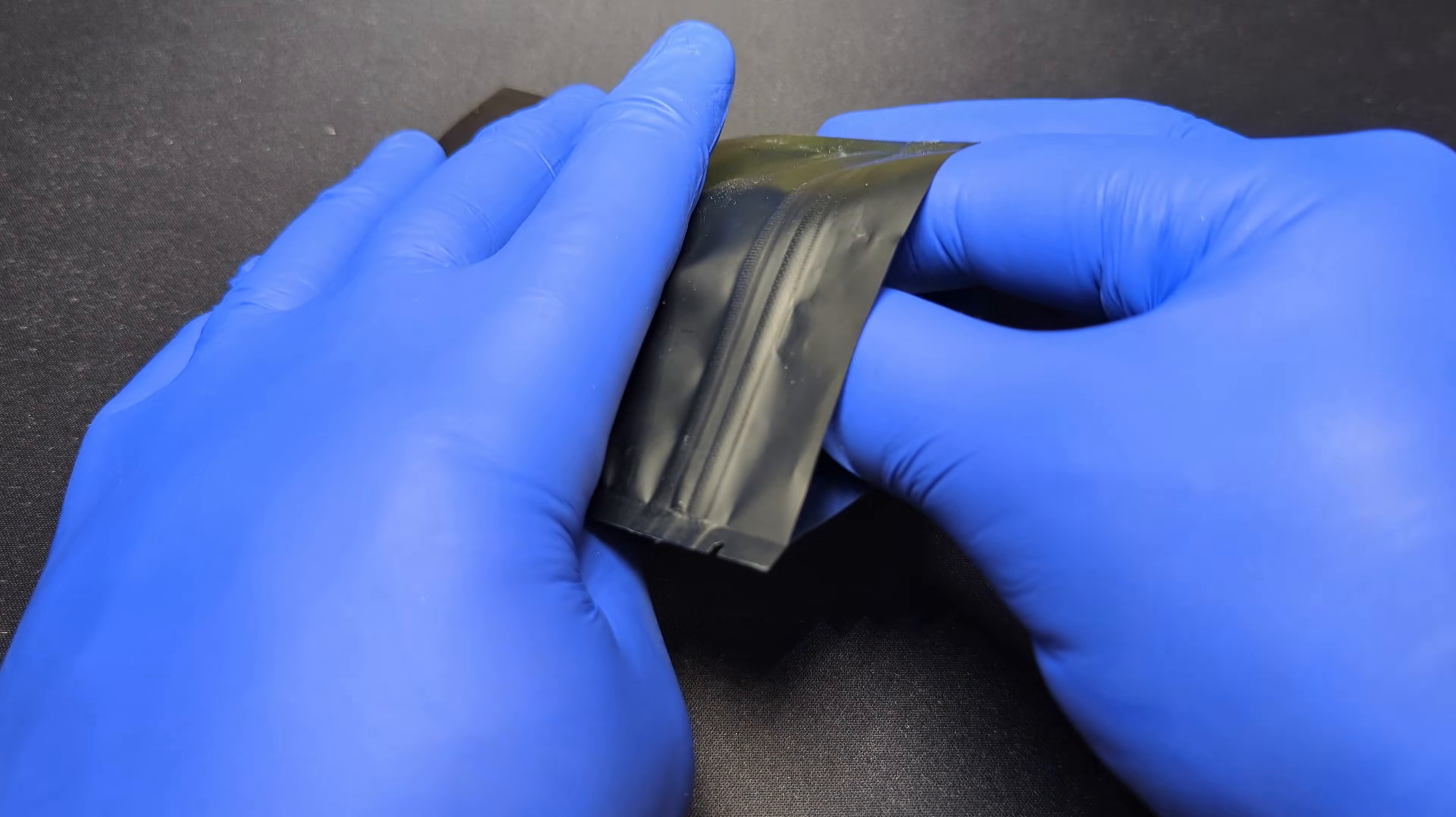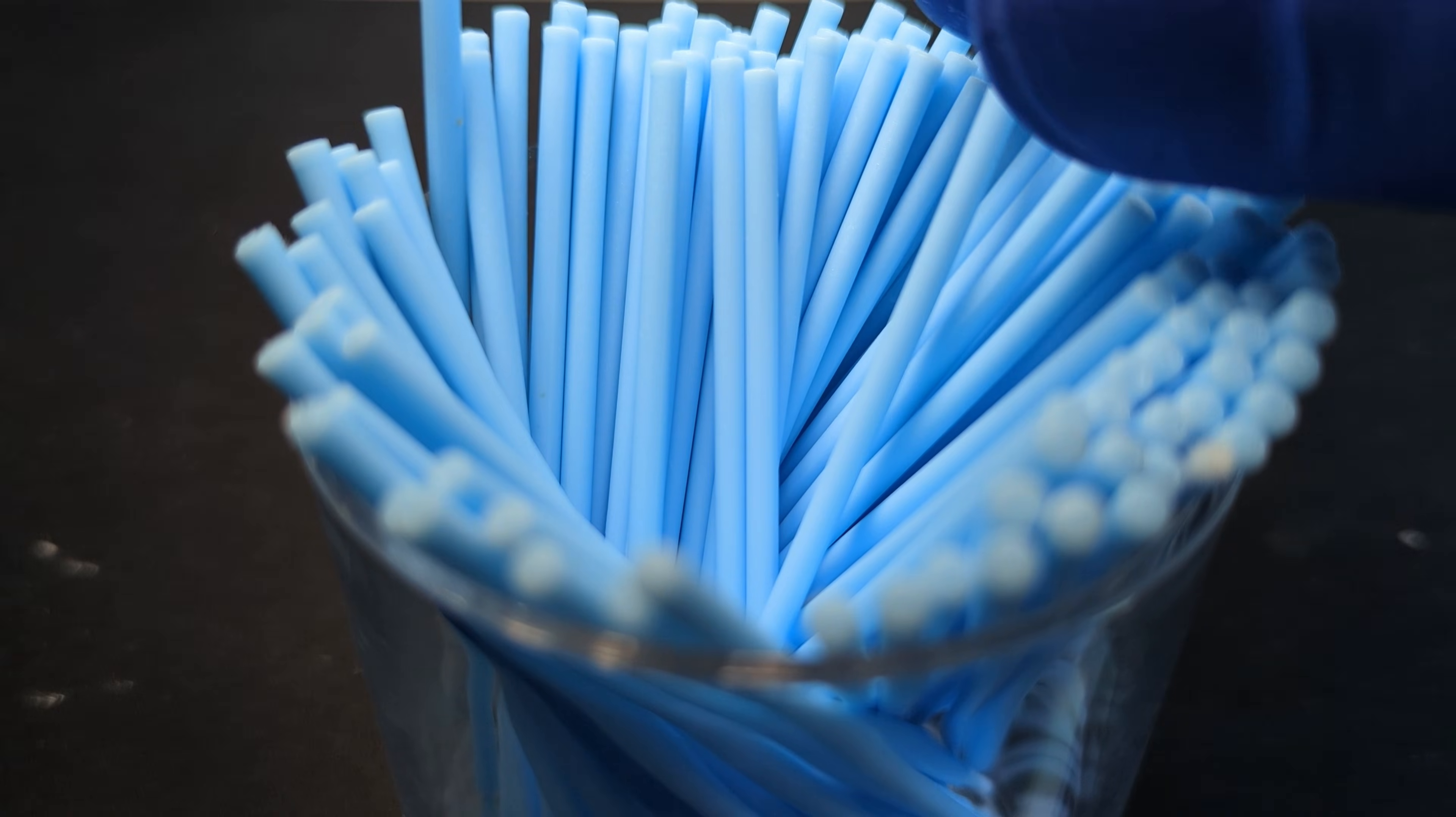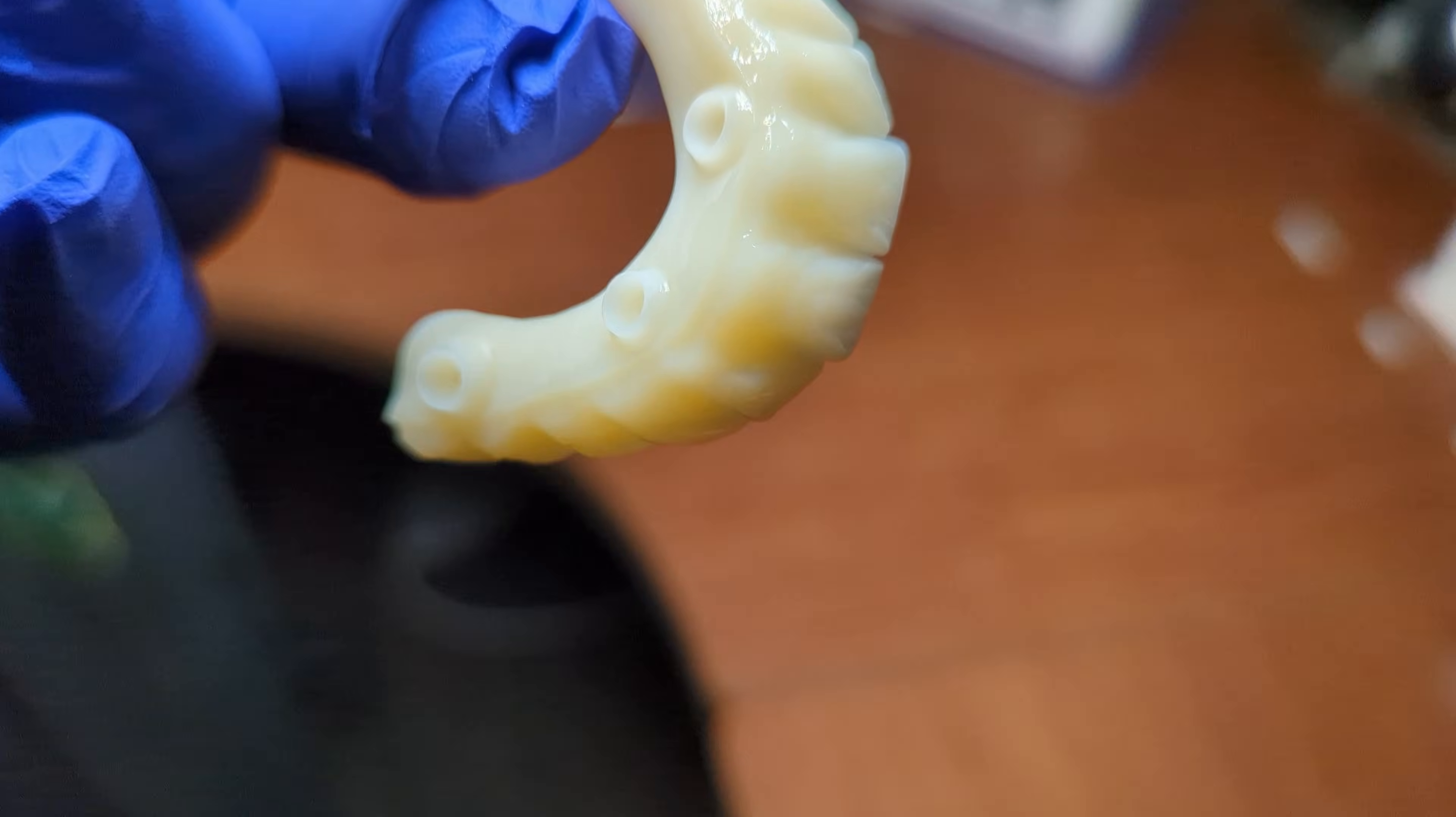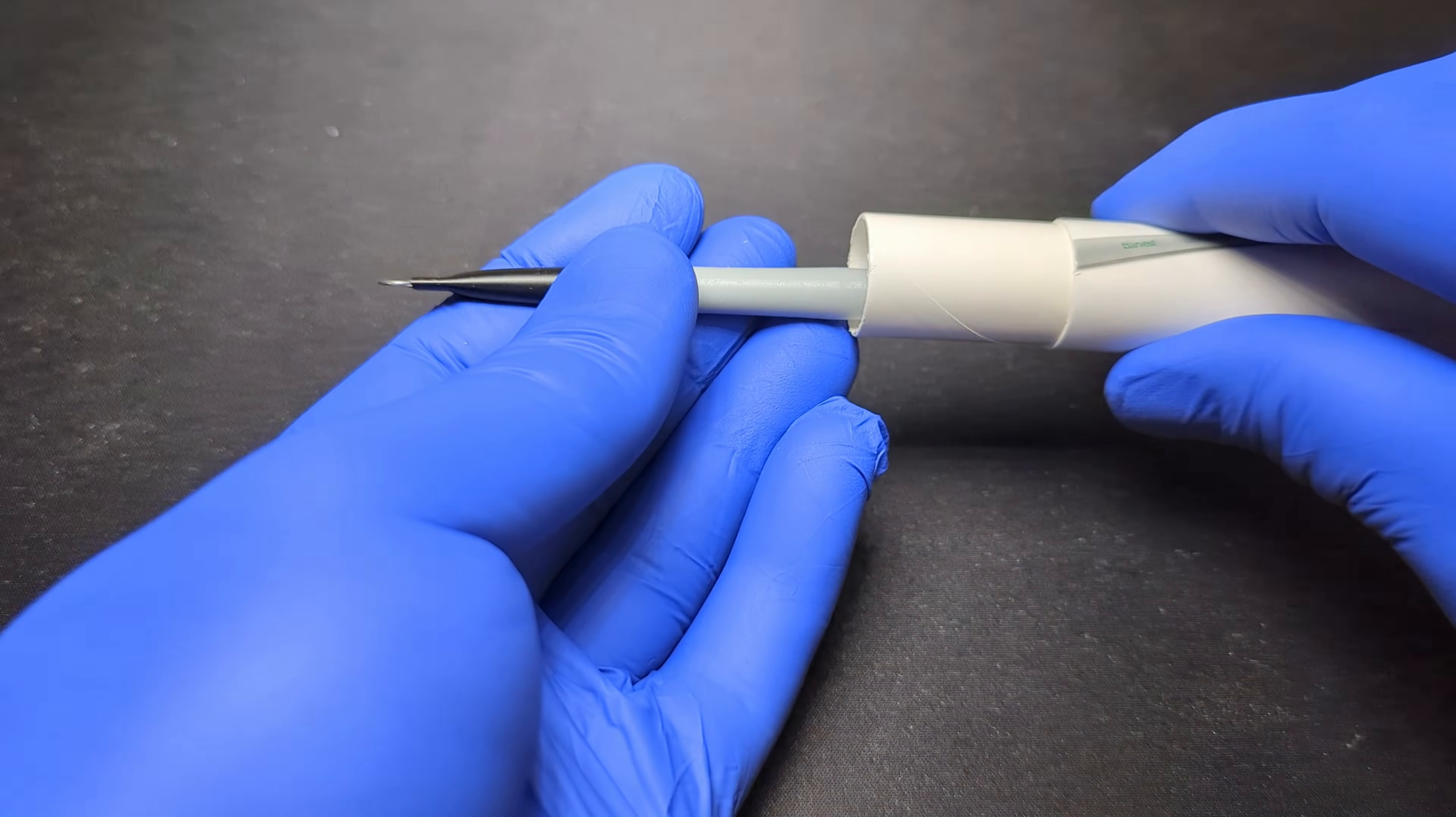The next part, applying the pink with EasyGum, is particularly exciting because it is a new and innovative product, and I am one of the first beta testers on the market. First, we need to apply a bonder to the PMMA surface. Harvest Dental recommends EasyBond, but you can use any other bonder like Bond LC. Only apply a very thin layer to the surface for EasyGum, and there is no need to cover the entire teeth. It is especially important to apply the bonder interproximal and about 1mm to the tooth structure. Then, light cure it for no more than 90 seconds in a curing box.